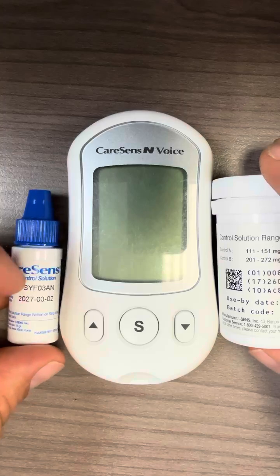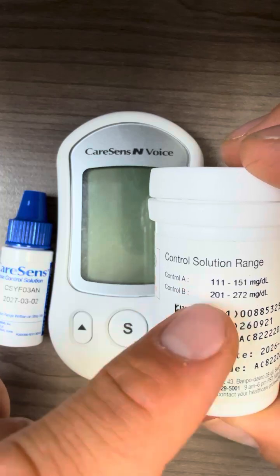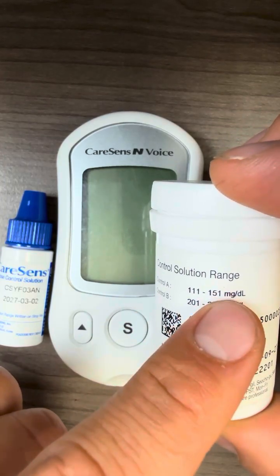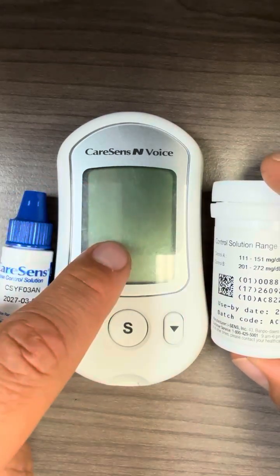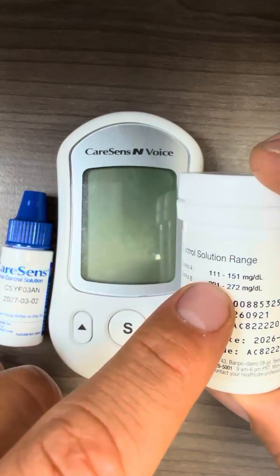First of all, the most important part is this range here. You will see Control A: 111 to 151 milligram per deciliter. So the control solution testing result shown upon our testing in this video should be within that range.